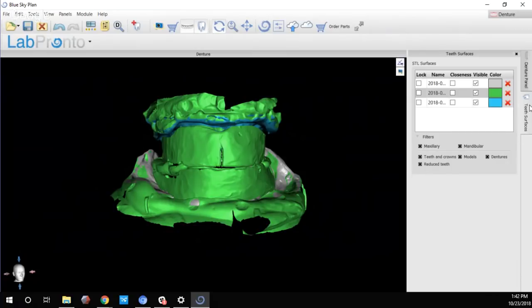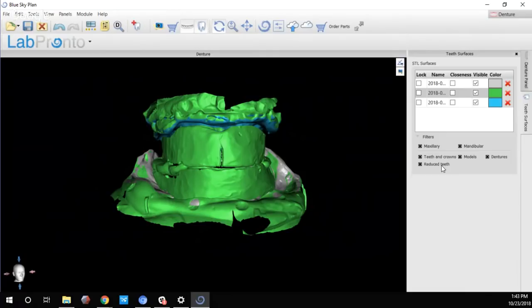In the Teeth Surfaces panel, we have filter checkboxes: Maxillary covers all maxillary surfaces, Mandibular covers mandibular data. We also have Teeth and Crown boxes. For dentures, we'll have the denture base, the reduced denture, the denture reduced coping, and the reduced teeth — a new data set created so that when we print the teeth they can be easily glued into the denture base. I'll explain this further once the denture is done.